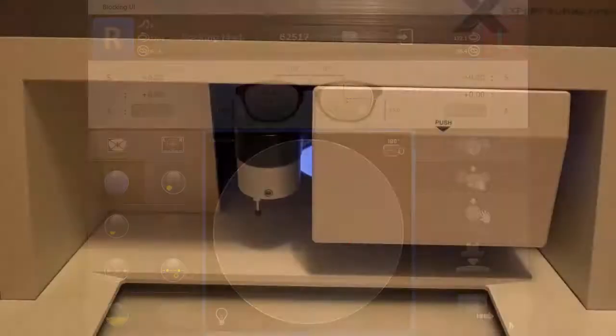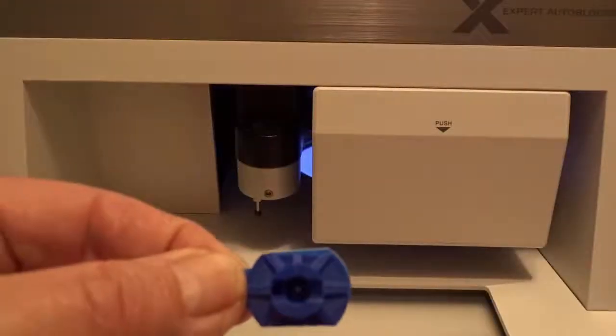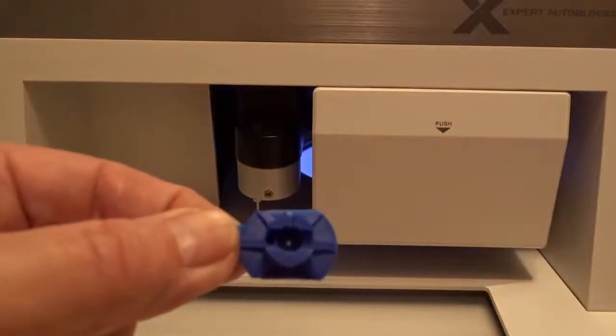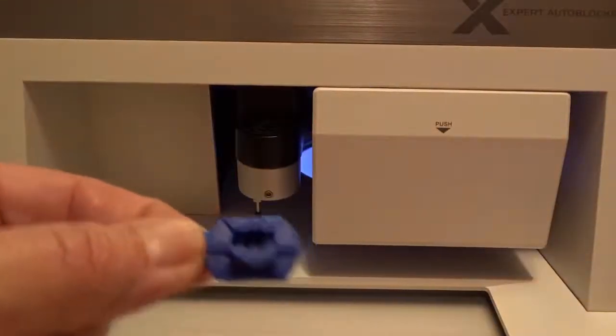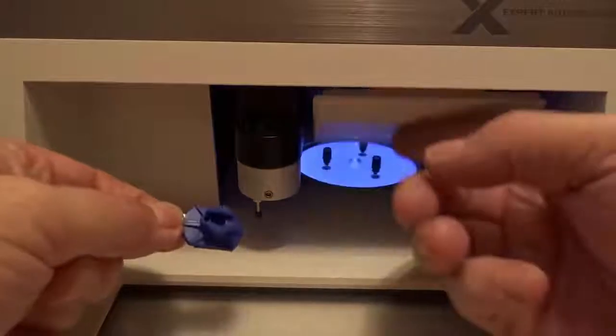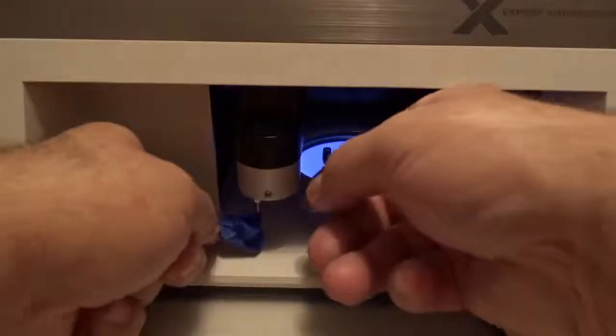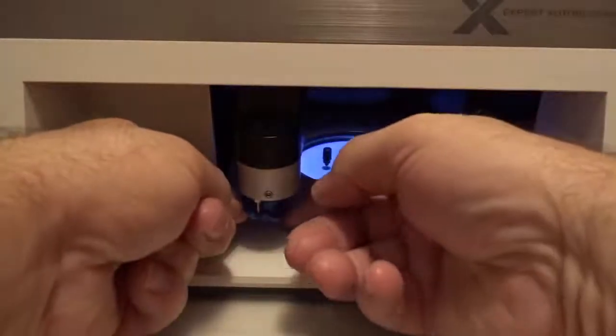Take your block with the Leap Pad attached and place it into the blocking arm. Always place the block into the holder with the hole facing to the left.